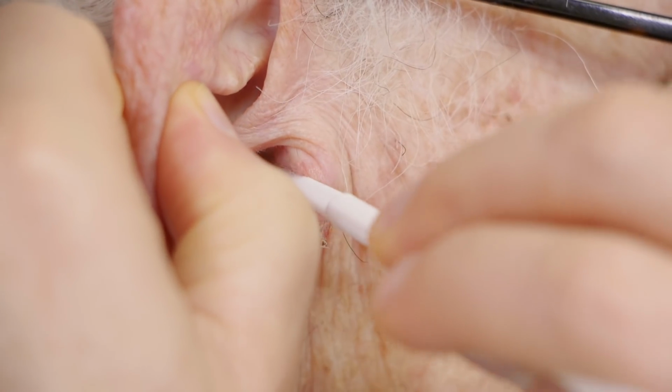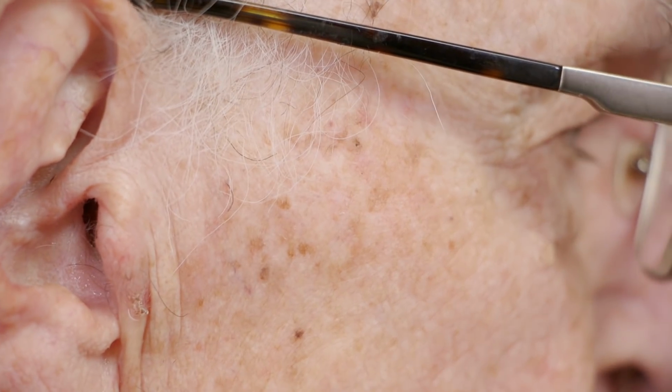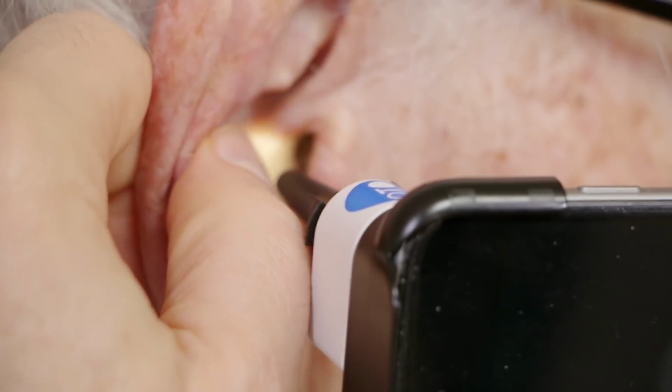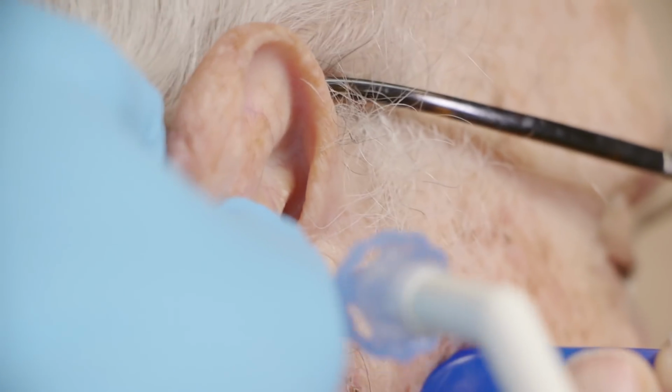Some of it's coming out. Just a little flake, really. I'm going to just take that off. See if that's what was causing the... Okay, now when we go back in, that made a big difference. But we still want to irrigate out the wax that's around the edges if they're going to be working in there. Okay, here we go again.